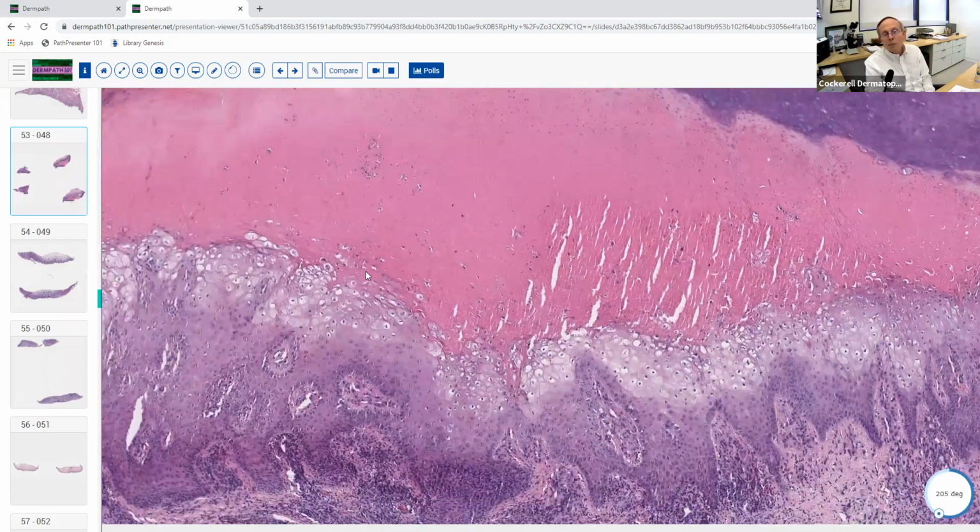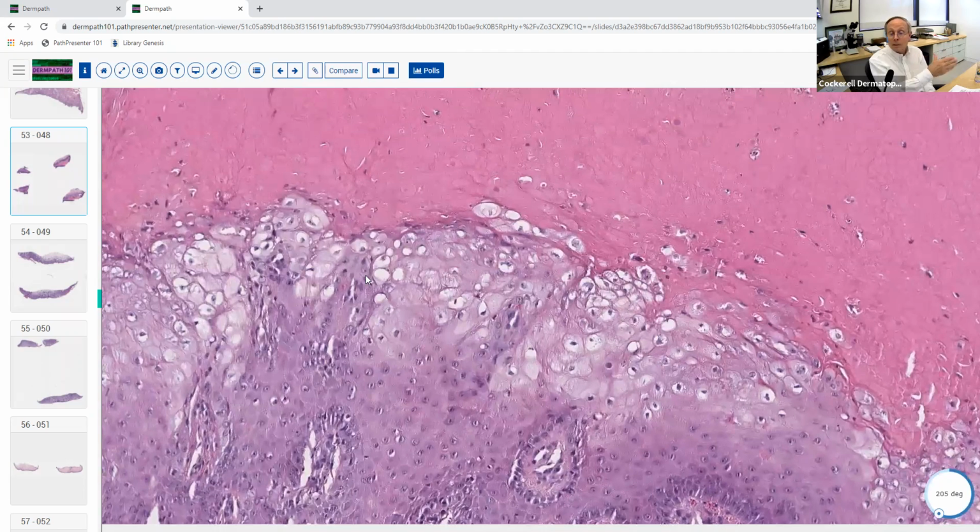So what causes ballooning degeneration? We had a previous case of nutritional deficiency, so that'd be one thing that you might think about. But this has also got these pyknotic nuclei, and it's got all these changes up here. And all of these cells up here that are dead, they're dead because they have been infected by a virus. So just like herpes virus infected cells eventually die, well, these cells also die because they have also been infected by a virus. So we have an answer here.